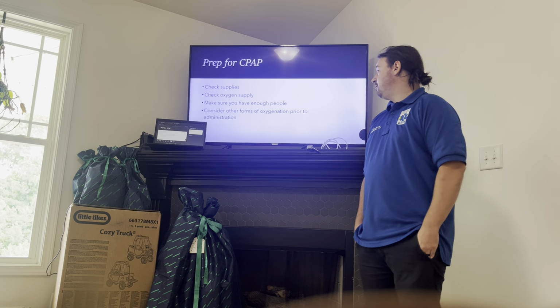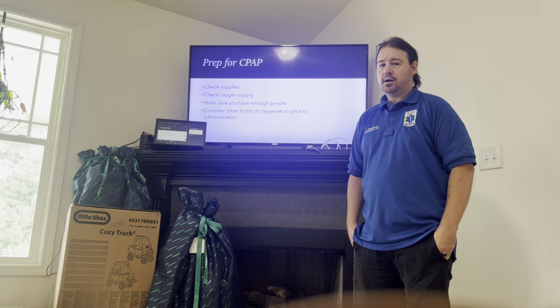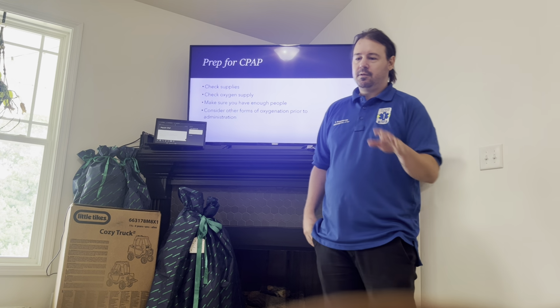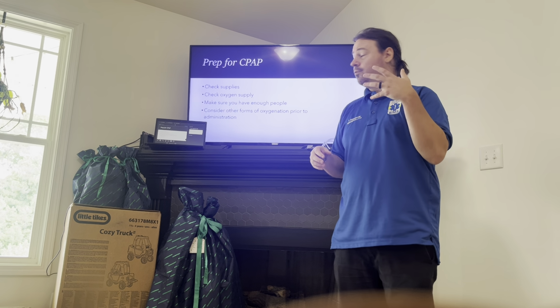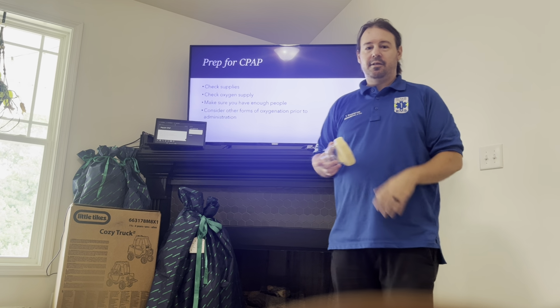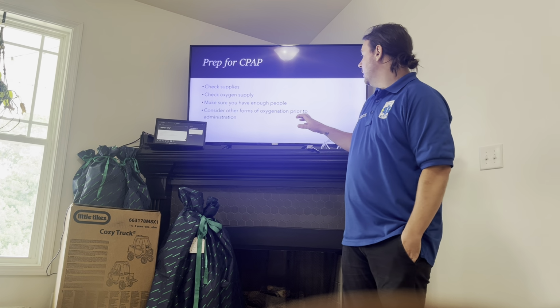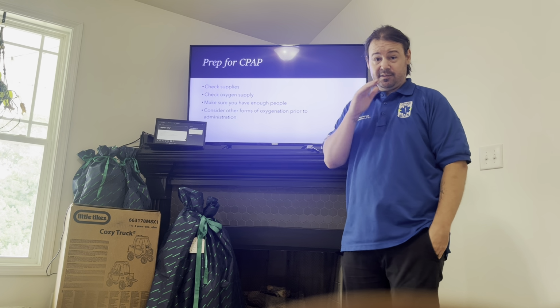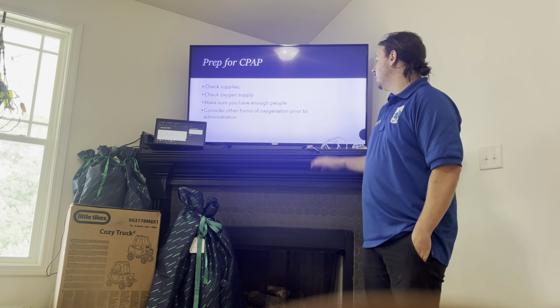Make sure that you have enough people around. CPAP is best done with 2 providers. It can be done with 1 provider, but it will be easier, more effective, and faster to have 2 providers. The reason is that everything with CPAP has to do with maintaining a good seal. If we don't have a good seal, you will notice the air coming out the sides of the mask, and then you're no longer getting that positive pressure, not to the extent we want. So having 1 provider hold the mask in place on the face while the other secures the straps is probably the ideal way to do it.